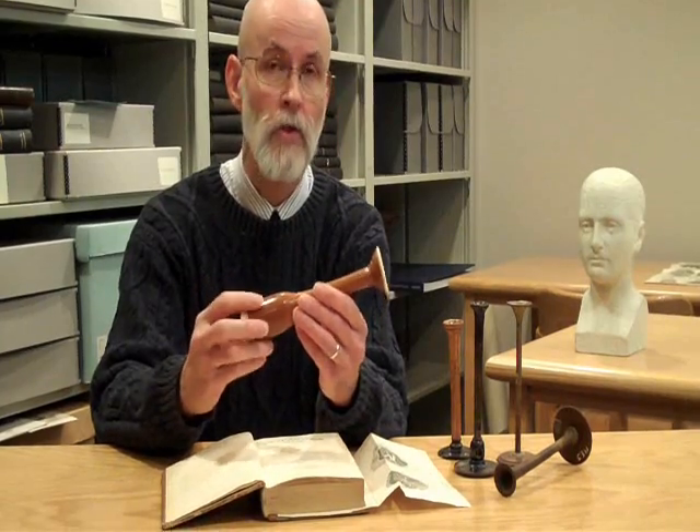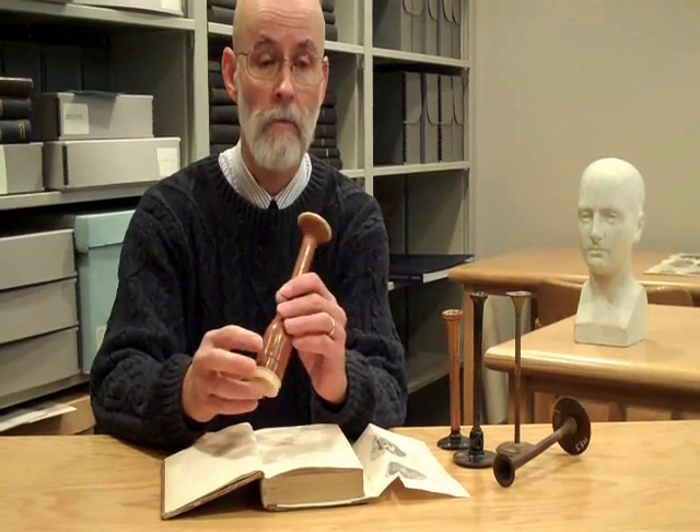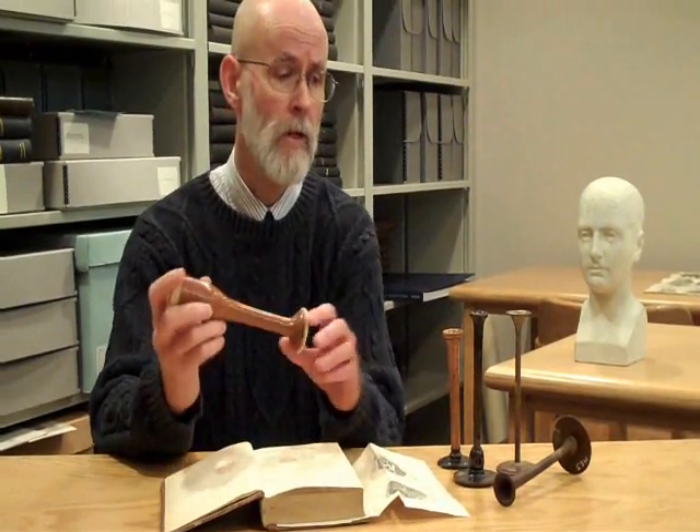This is a monaural stethoscope — actually a model of Laënnec's original stethoscope. And as you can see, it's really a wooden version of a rolled-up piece of paper.